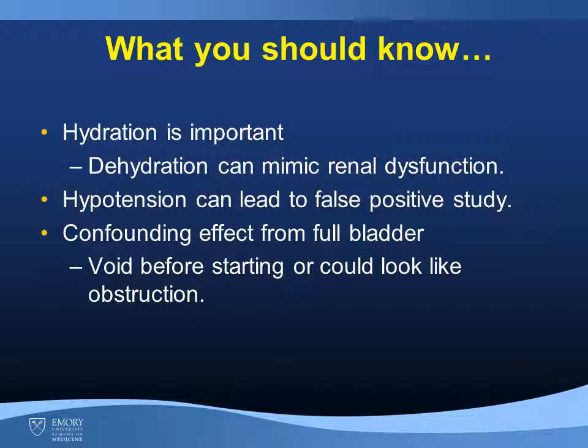So there's some key information you should know about doing renal scans. First, hydration is important. If a patient is dehydrated, this can mimic renal dysfunction. Also, if the patient is hypotensive, this can lead to a false positive study. And finally, a confounding effect from a full bladder can look like obstruction, so you want to have the patient void before starting the study.